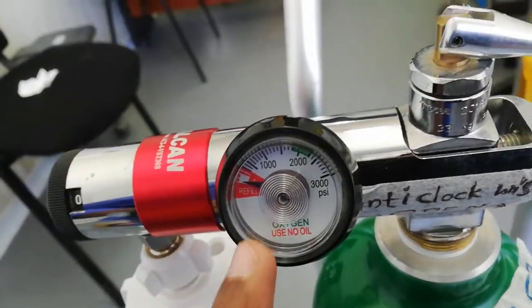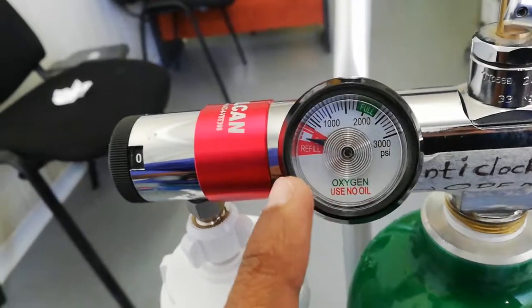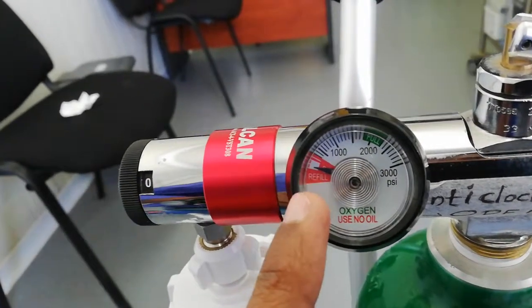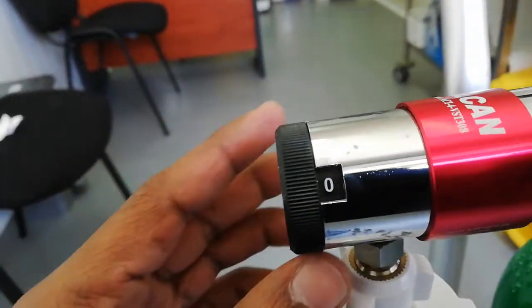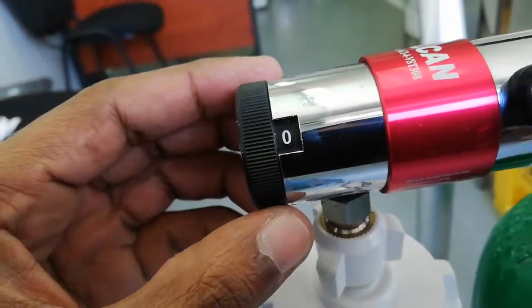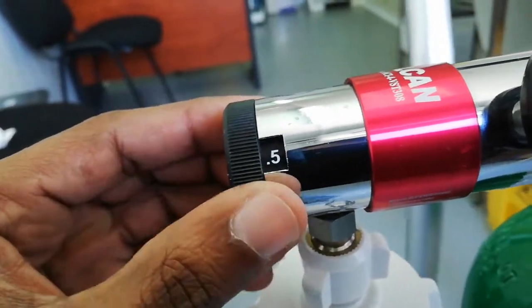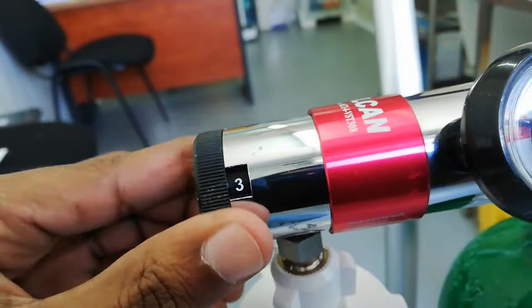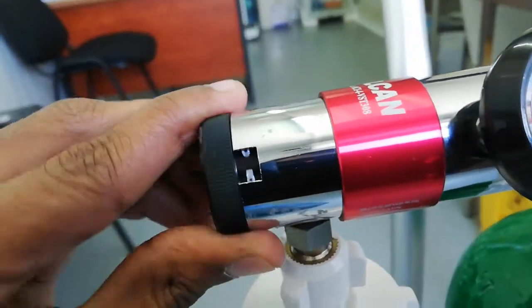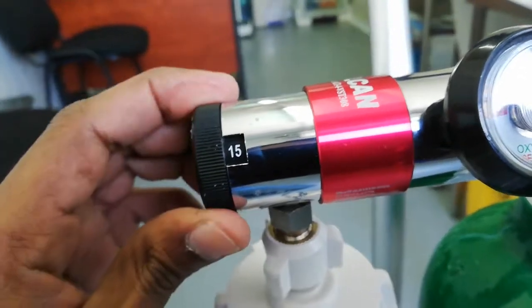Now it's off and low. This is the full range. For the nasal prongs, we start at 0.5 liters, then 1L, 1.5L, 2L, 3L, 4L. The maximum is 15 liters per minute.